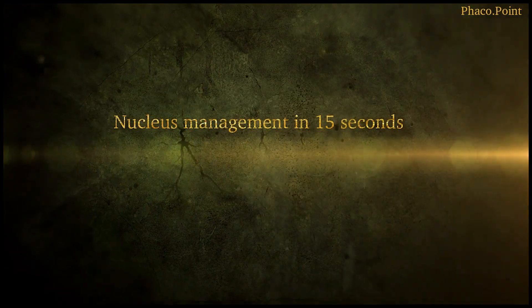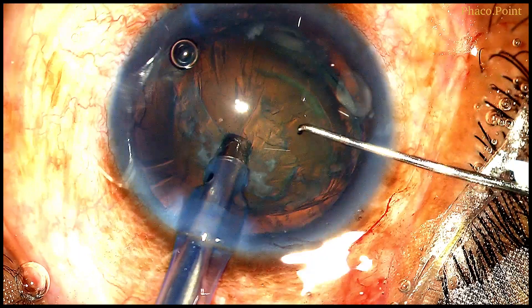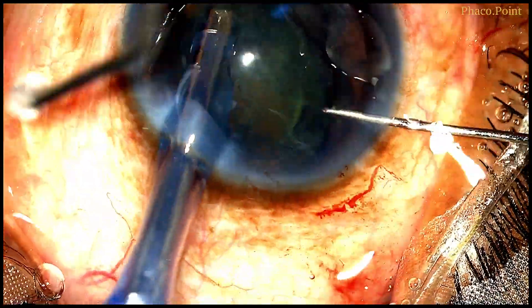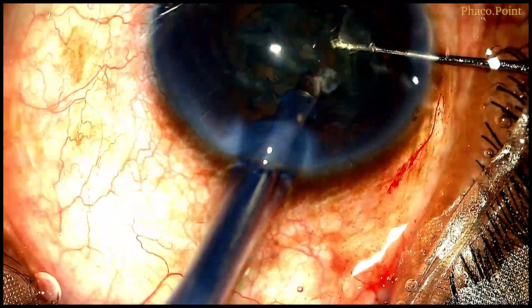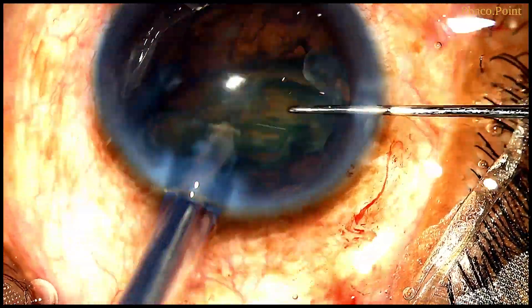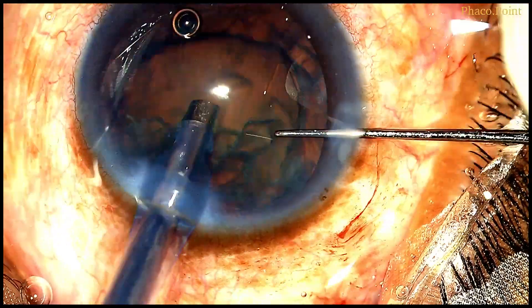Now, nucleus management in under 15 seconds: with the anterior chamber insufflated with viscoelastic, the phaco probe and the Sinski hook are introduced into the eye. The Sinski hook is held behind the nucleus, and watch how — using just the fluidic forces with the foot pedal in aspiration mode only — the nucleus is downsized and emulsified.